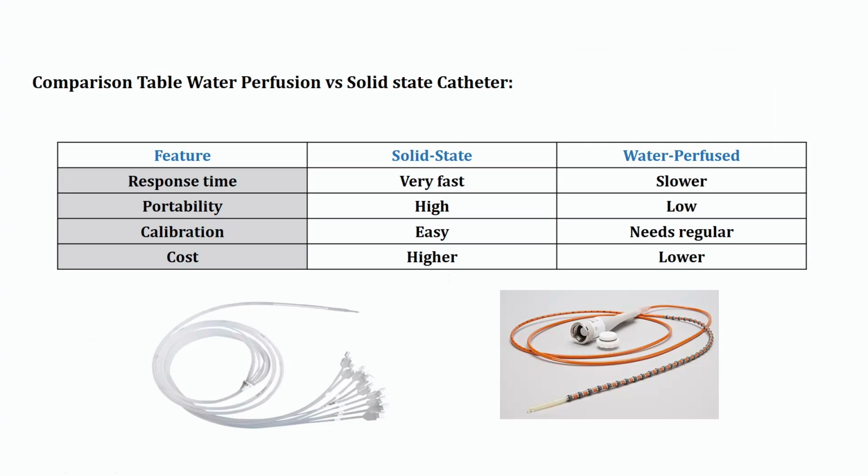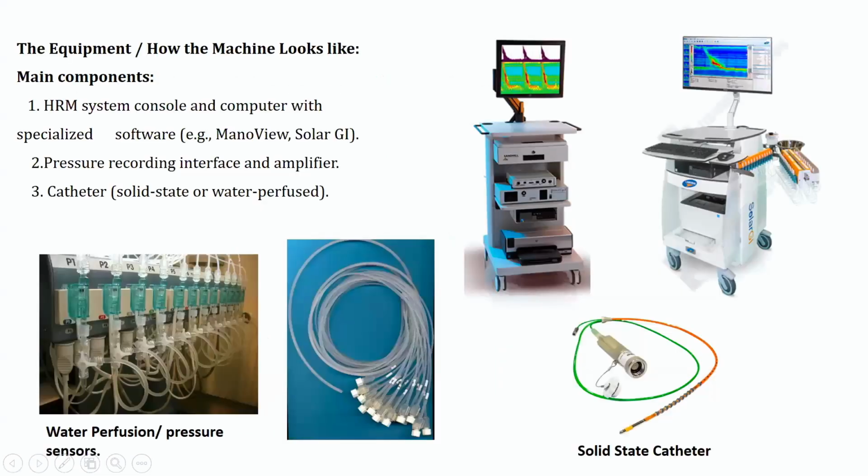I always try to repeat the things that you have described, just to make sure that I've grasped everything you have explained so far, so that you can follow up if anything is inconsistent. So in general, with this system, there are three things we're dealing with. We have the catheters, the different types that we were talking about, then we have the interface unit, which converts the analog signal to digital data. And then we have the software that shows us the topography, right?